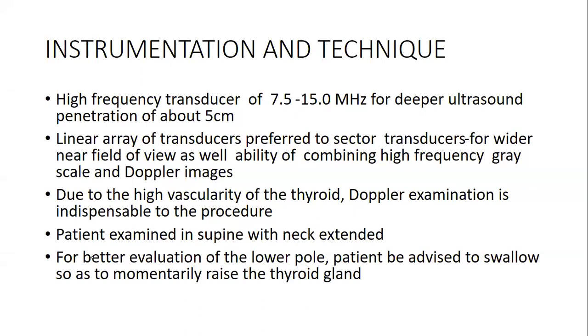The patient is usually examined in supine with the neck extended. For better evaluation of the lower pole, the patient may be advised to swallow so as to momentarily raise the thyroid gland. I think that's very important. So the patient lies supine with the neck extended so that it's easy to evaluate the thyroid, but it becomes more prominent if the patient does the maneuver of swallowing, so that it can raise the gland.